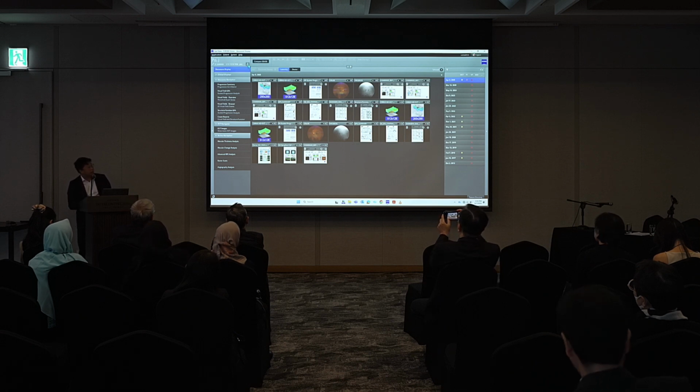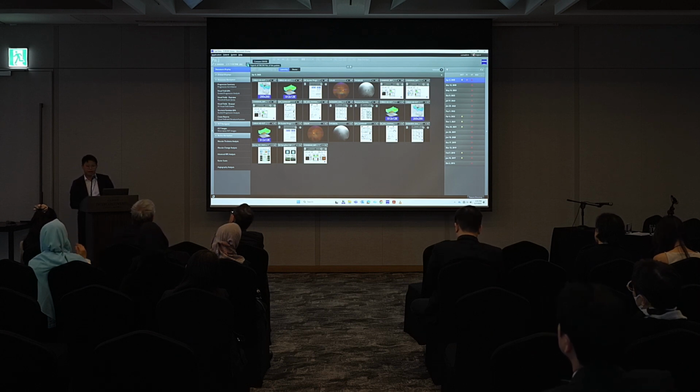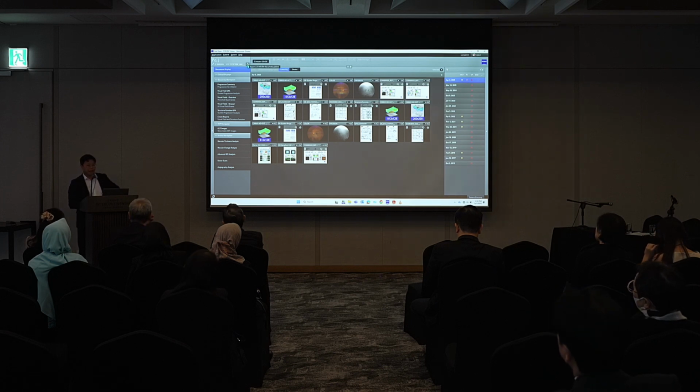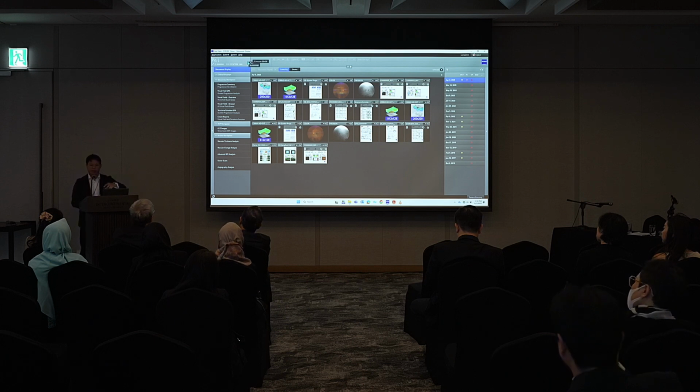And what's really nice about Glaucoma Workplace or Forum is that if you see this button here, there's an export all DICOM files. So look, I'm from Australia, right? And obviously we don't share our network. But you can really, with the click of a button, export all the patient's past history and DICOM files, this patient was about 400 megabytes, send it across the world, give it to the patient on a USB, and they can upload it wherever they go with all their previous OCTs and images. So I think that's really nice.